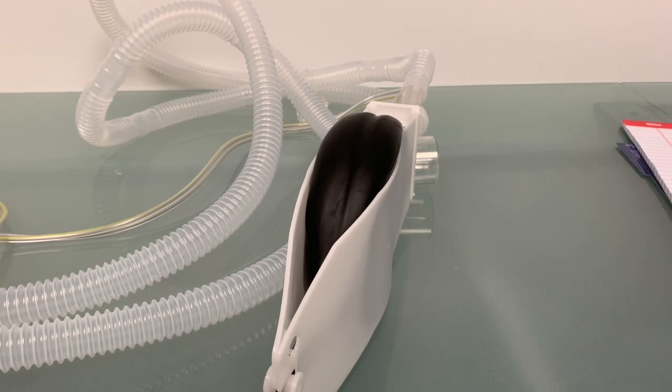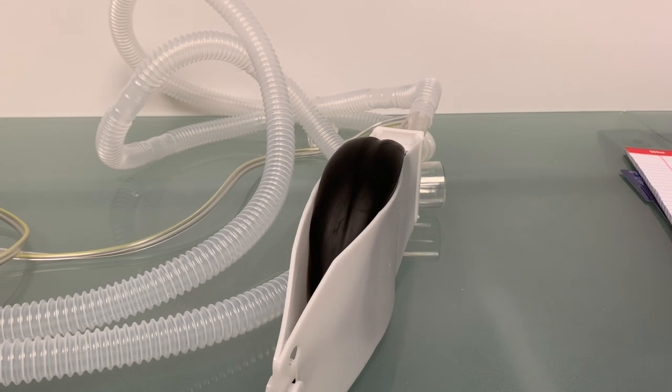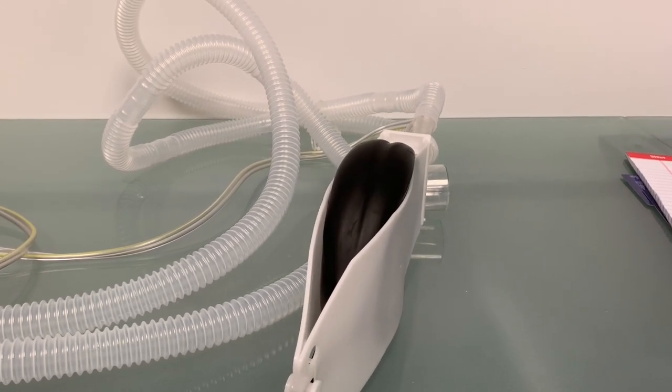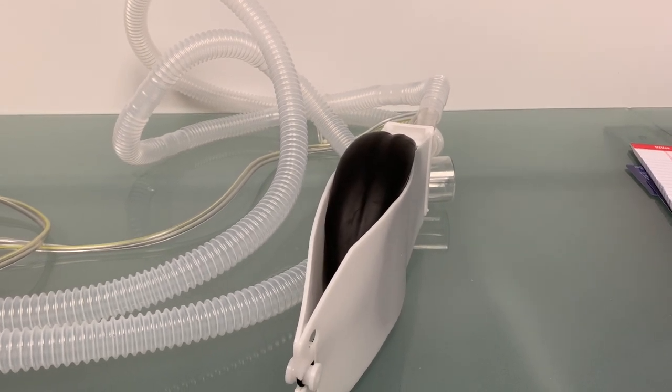With those initial settings, this is what the test lung looks like. You'll notice that the test lung and the initial porcine lungs are very similar, with a 4-second inspiratory time and CPAP hold, followed by a very short expiratory time with PEEP.